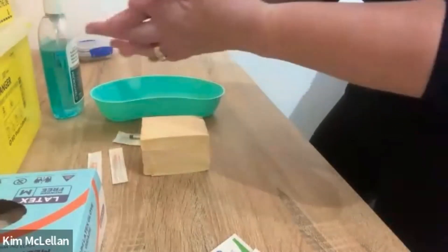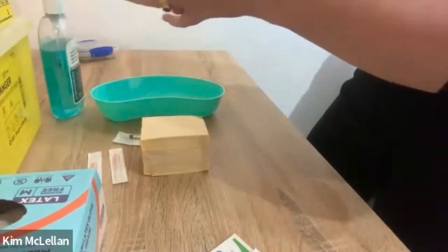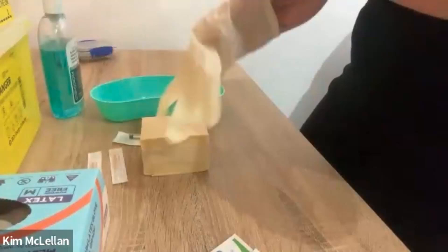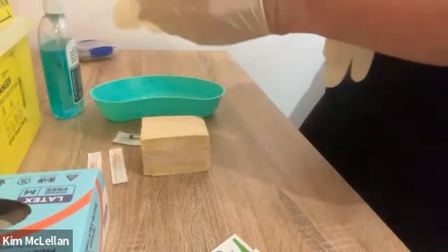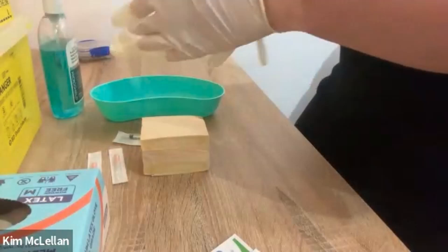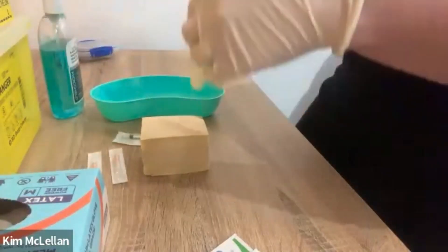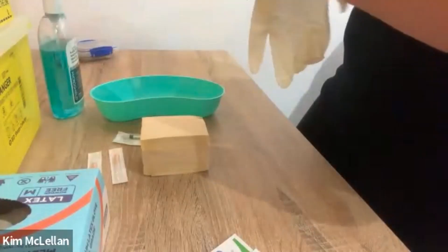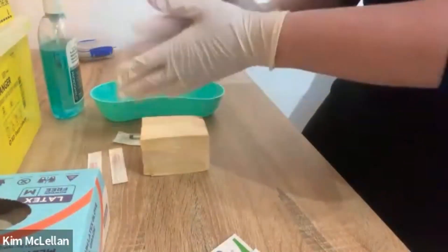First of all, I'm going to wash my hands, and then of course we're going to apply some gloves. If you don't have gloves available, you still need to verbalize that — you state out loud that you're going to be applying gloves.